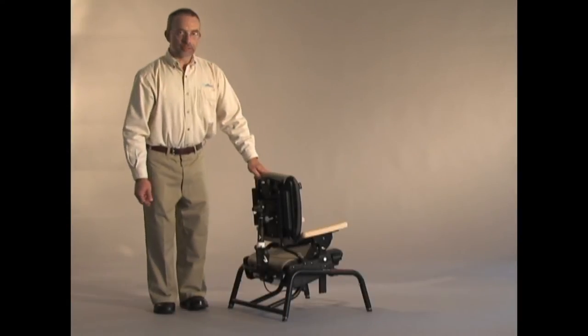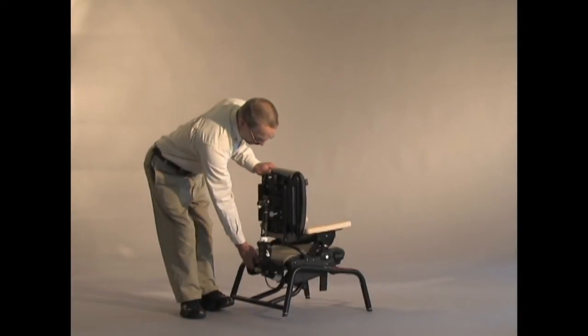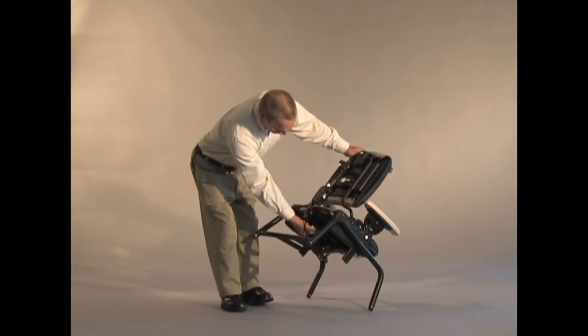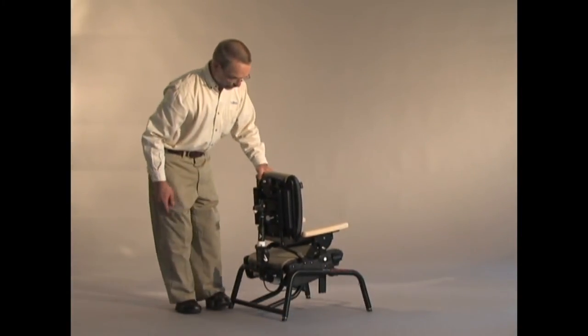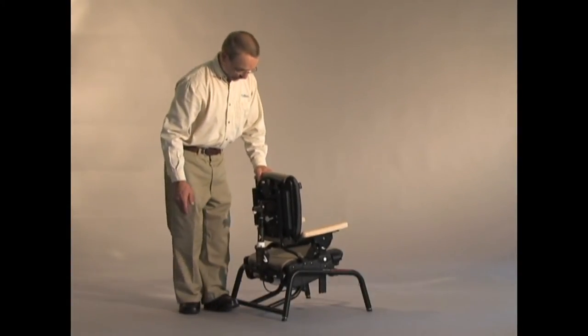We have a similar feature below the seat. I'll raise this up so you can see what I'm doing. If I rotate this handle, I'm activating a compression spring below the seat. Now we have ten degrees of bounce below the seat.